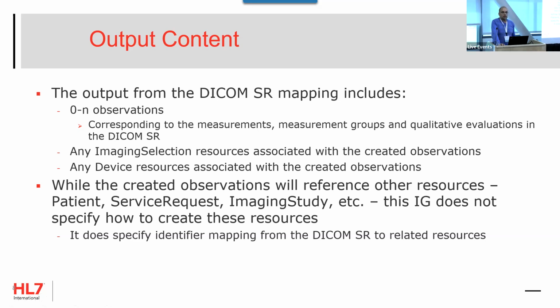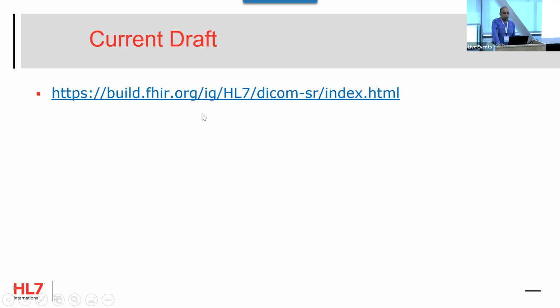It can represent, for example, different lesions, and for each lesion, it can describe the volume, short axis, long axis, and even some qualitative assessment of the lesion, like the morphology, the margin, and other aspects of the lesion of interest.